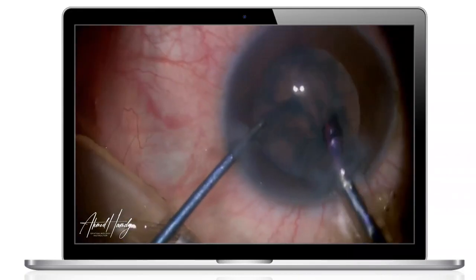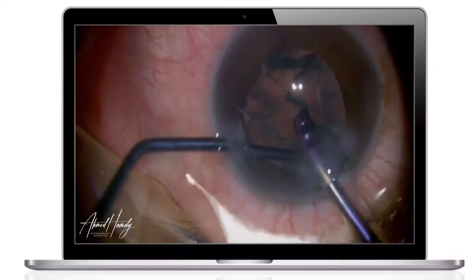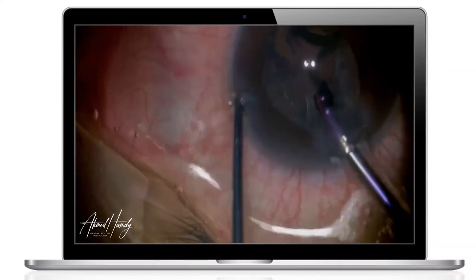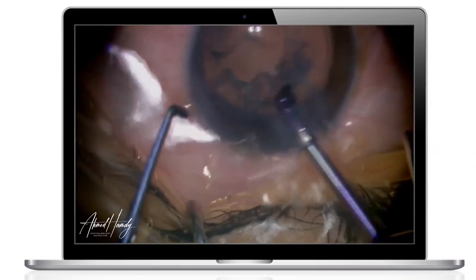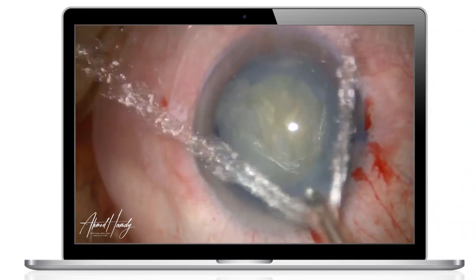Dr. Marwa is asking, how can I adjust the microscopic illumination during the surgical steps? Well, actually, you can either use the direct illumination or the red reflex mode. You can use it depending on your preference. So sometimes you can use them during capsulorhexis. The red reflex will be better for the capsulorhexis, and for the nucleus management, you can choose any one of them depending on your preference, either the direct illumination or the retro illumination from the fundus, like that. Yes, Dr. Yahya.